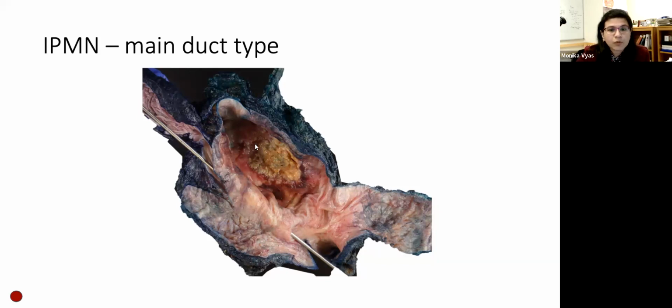You definitely want to sample any papillary looking or solid areas, but the general recommendation is to submit the entire cyst if you cannot see a clear invasive carcinoma associated with it. So oftentimes we get pancreatic resections which are 5 or 6 trays and slides running in hundreds, because we couldn't see a clearly invasive component, and we end up submitting the entire cyst lining for evaluation.